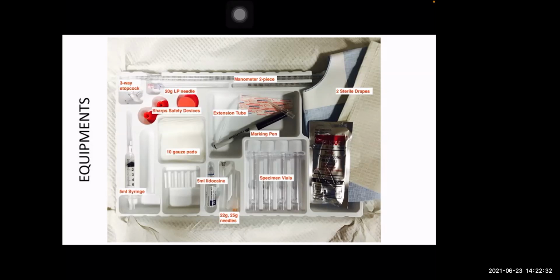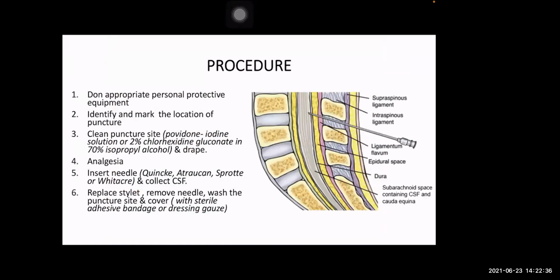Okay, so for the procedure itself, we should first wear proper personal protective equipment depending on the infectious risk. But usually we just need level 1 PPE. And then we should first locate and mark the puncture site. Since the conus medullaris ends at the level of L3 in children, we can choose the interspace between L3 and L4 or L4 and L5 as the puncture site. For the landmark, generally L4 is located in between the imaginary line that connects the two posterior superior iliac crests. So we can choose the space above or below L4.